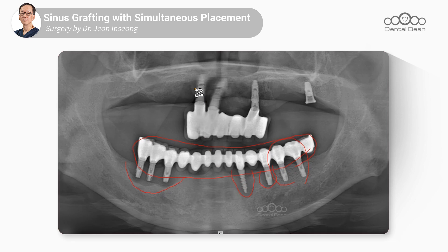Currently, the upper jaw has three implants supporting a bridge, which is also functioning well, so we will leave it alone for now today. Since it hasn't been long since the implant on the left upper was removed and the soft tissue has not fully healed, it would be better to wait a bit longer for this area.